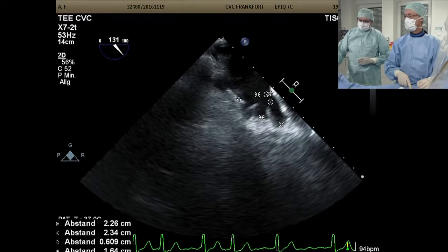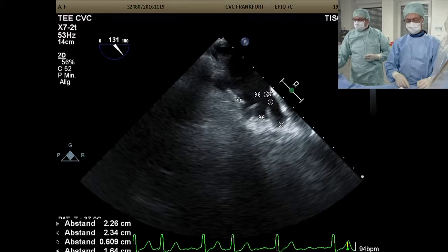Iqbal, with this fantastic imaging, isn't it one of those really shallow ones that either you do as Bushra suggests and don't do it, or use what was shown by Kevin yesterday, that funny LAMBRA device with a small waist? Kevin, is that what you would go for? Yeah, let's see what the angiogram looks like.